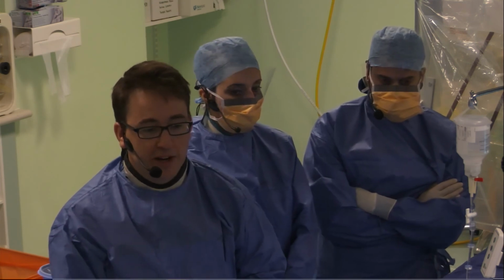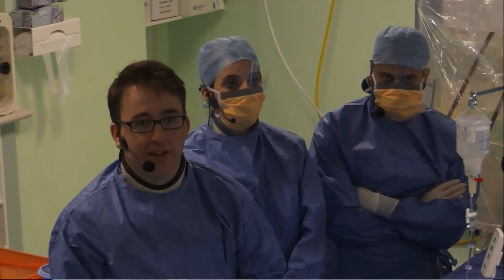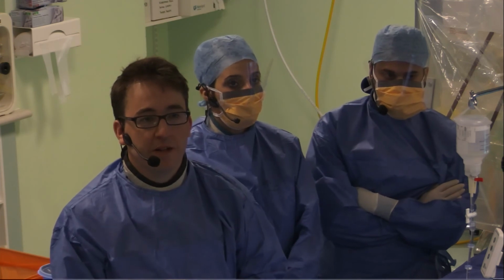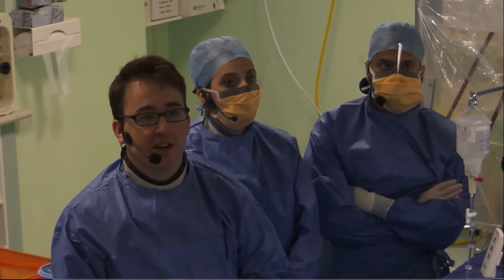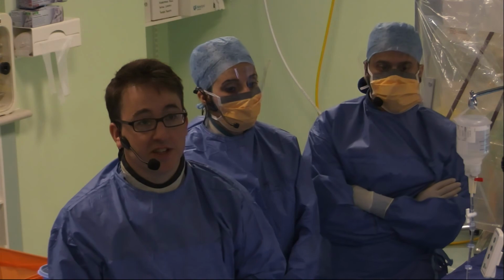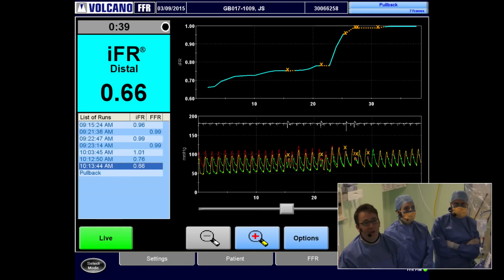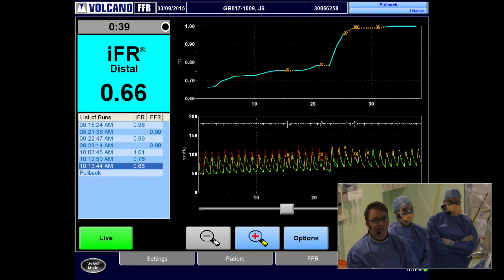Now, I think there's a question which has just come in regarding this slide which Dr. Nidja showed you, and that was from another case completely. So that's showing an IFR value of 0.85. And perhaps why don't you show that case again, Suk? And that's just from an illustrative slide. It's not from today's case, but it just very nicely illustrates in a similar way to today's case how the IFR values can change. So that's a pre-prepared PowerPoint from another slide, another patient. And then if we flick to today's live values, you'll see, strangely enough, we have very similar data, whereby we have diffuse disease and then a more focal disease, but clearly these are very, very different numbers and different patients.